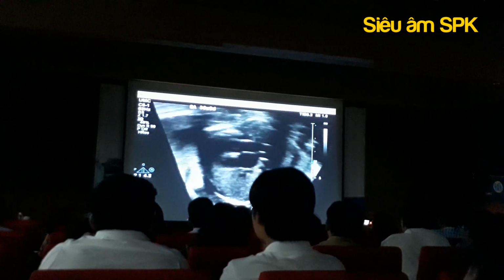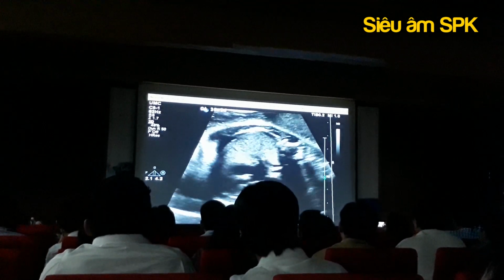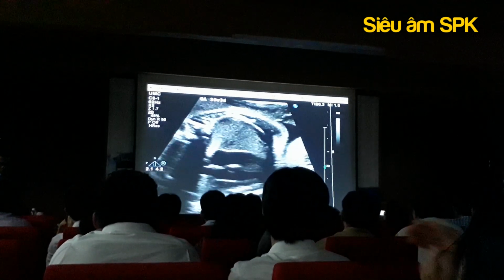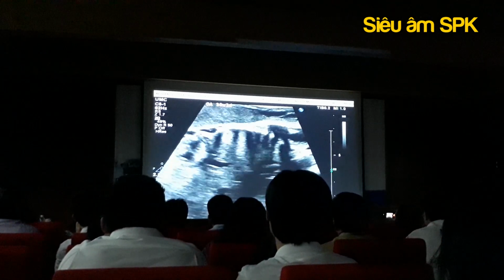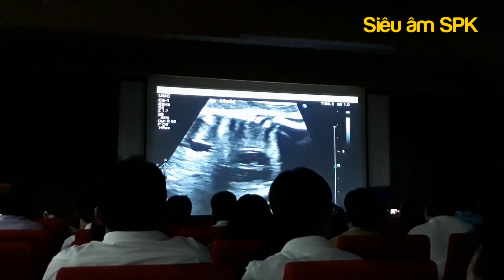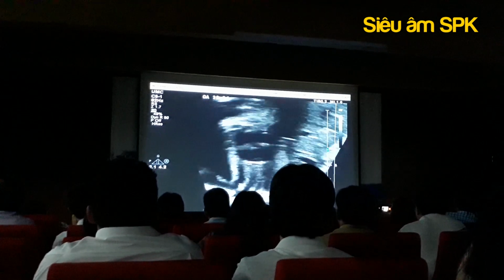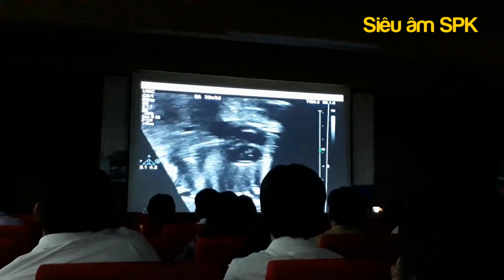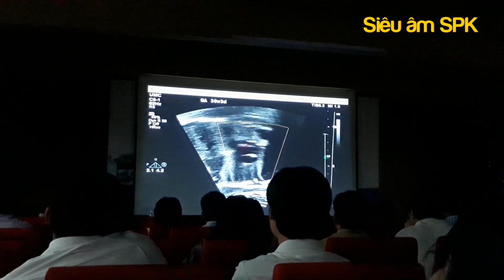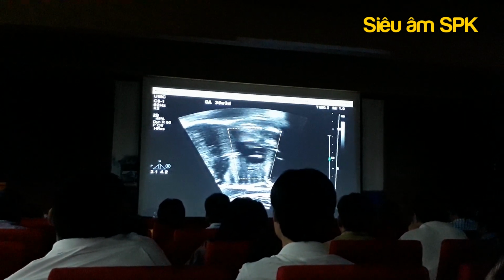So I'm going to think about what kinds of things go with double outlet right ventricle. And I'm going to examine closely the AV connection, make sure that there's no abnormality of the AV valves, no straddle. Vì bây giờ mình phải coi lại cái nối giữa nhĩ với thất nó có bị bất thường gì hay không, coi thử có tổn thương gì cái chỗ nhĩ thất hay không.